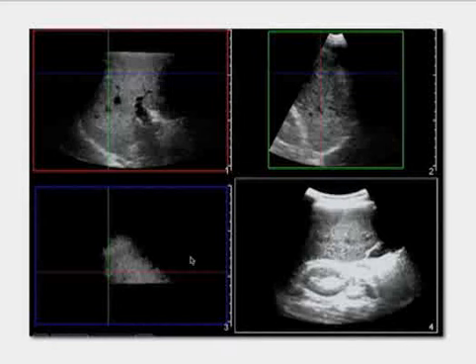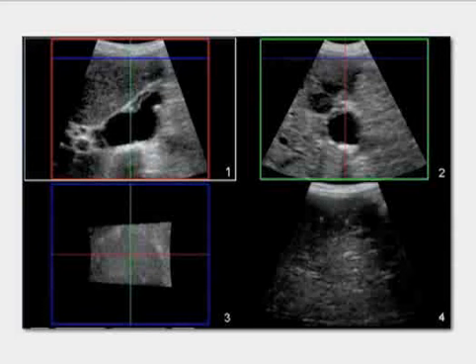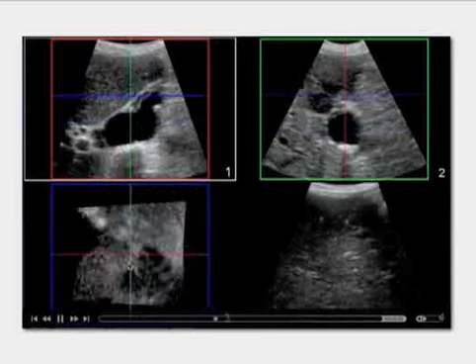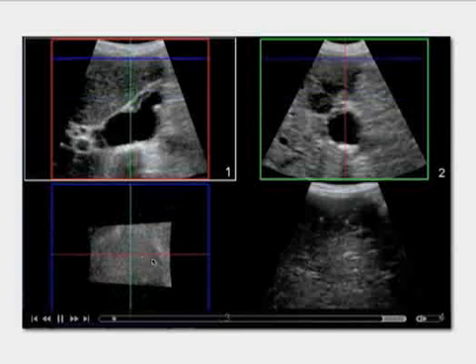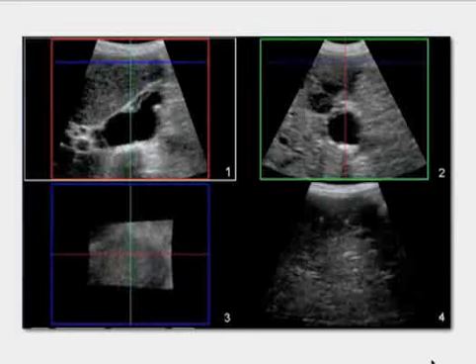Here's another example of multi-planar imaging and its value in the liver. This is a 3D process, essentially taking the 3D volume data set and dissecting it in different planes. As I put this into motion, you can see an area in the gallbladder that is thickened — this represents gallbladder tumor. Next to it, you can see a hypoechoic area within the liver. As this goes back and forth in the reconstructed C plane, you can see that this area of decreased echogenicity is contiguous with the area of thickening — representing local extension of gallbladder carcinoma. Again, it's all about clarifying relationships.